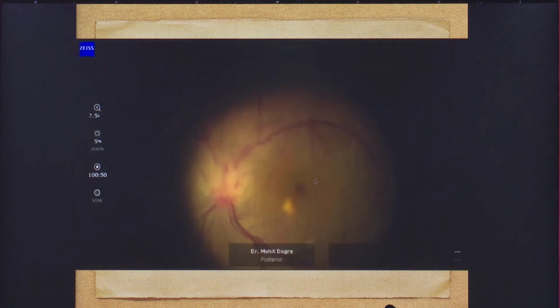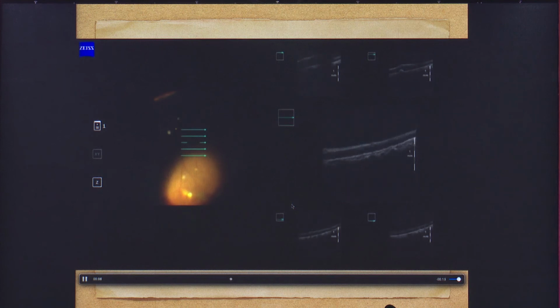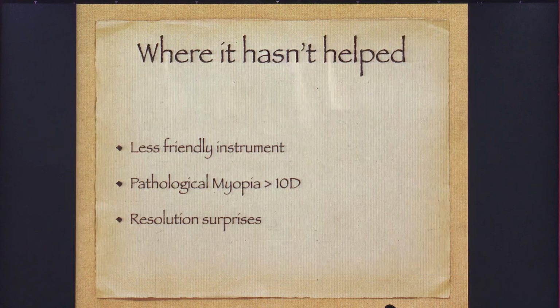And I think Mohit will be showing this. This is his video. Whenever you want to take a biopsy, here you have a lesion suspected of lymphoma, and there was a peripheral lesion also. With your green tip, you can literally see whether you have gone to the right plane. This is a still from that video. Because the green tip is not blocking the rays, you can see the cells moving into the green tip. This is how you can know whether you have taken a good yield of the tissue, so that you can send it for the biopsy. Mohit will be showing more of these videos.